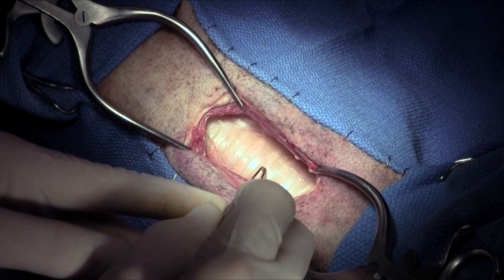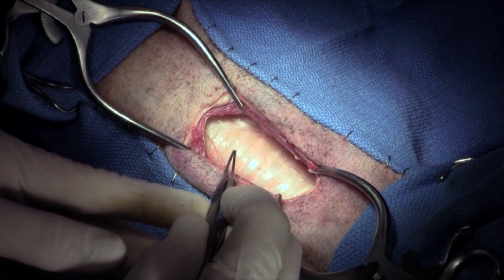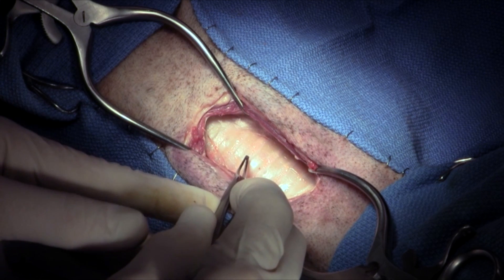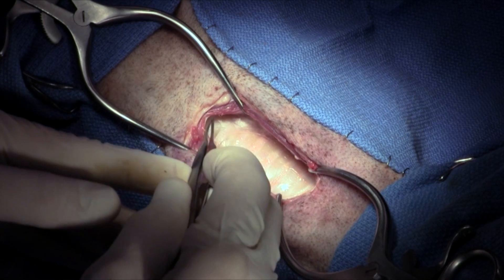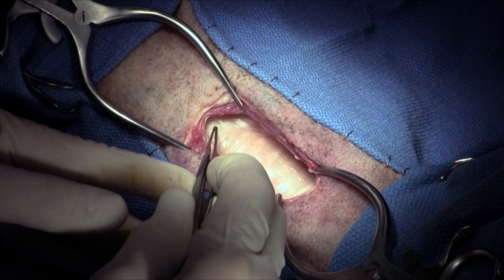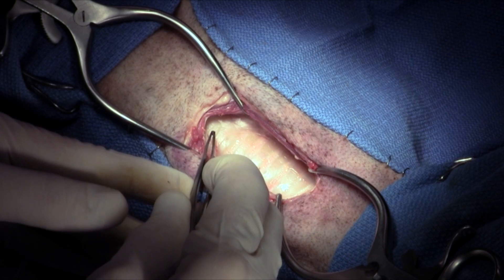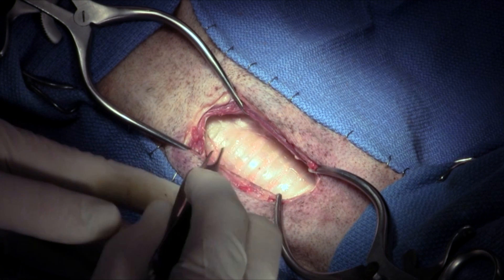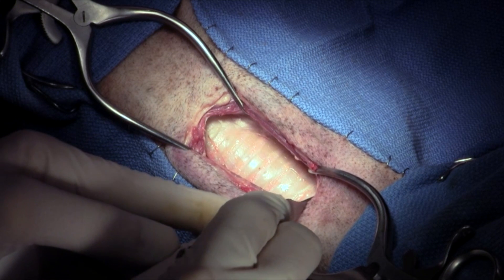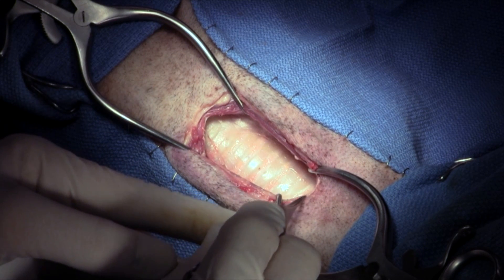The tracheotomy incision is made between or in the area of the fourth through sixth tracheal ring. If the incision is made too far cranially adjacent to the larynx, increased coughing might be expected from the tracheostomy tube. If the tracheostomy tube is placed too far toward the thoracic inlet, care of the tube becomes more problematic.